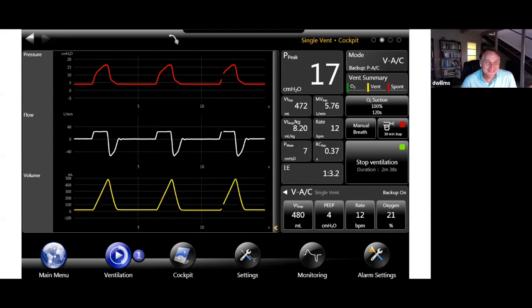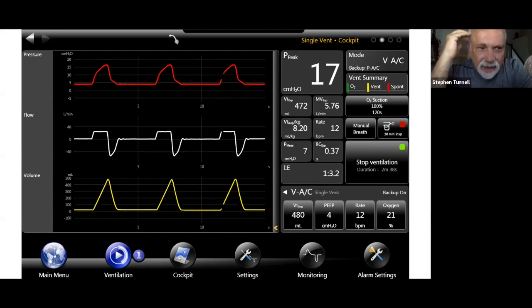Right. I would say my opinion is that it is, in terms of the ultimate value or the ultimate elements that you make your assessments on, it's just that I think what Graeme is referring to, and I could be wrong, is that there's a lot of smoothing routines that occur in the application of user interface technology.